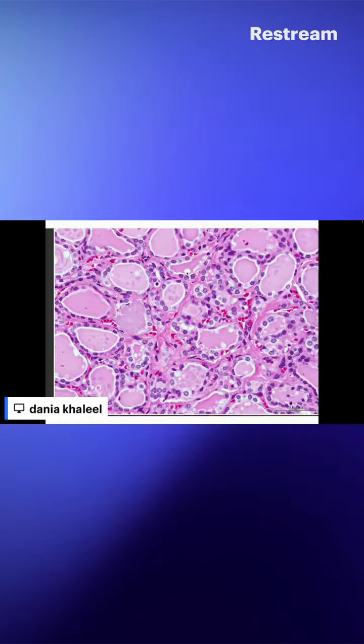I'm assuming so. Okay. So this is really nice that you mentioned that. We're going to discuss it later, but when the thyroid is active, it does something called scalloping of the colloid. It's like an empty space, because the thyroid is active. We see these more often in hyperthyroidism cases, like Graves' disease, where the colloid would have these empty spaces, which means that the thyroid is hyperactive and secreting a lot of hormones.